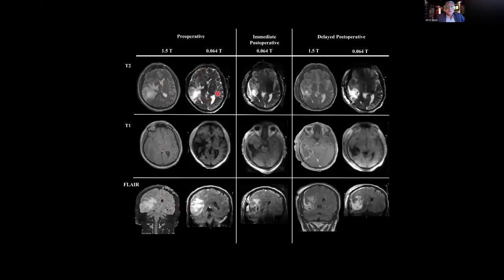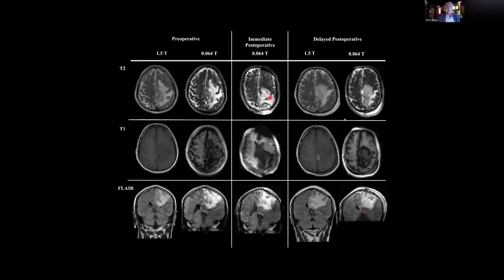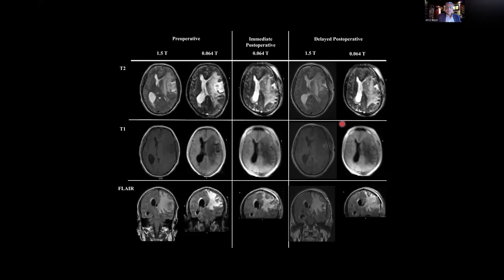If I get this picture, this is more than enough for me to make my plan. It would be good to have a high definition image, but this is more than enough for me to plan somewhere up in the boonies when I come across this patient. And then you can get a delayed post-op MRI, which shows what kind of surgery was done. It does give me a fair, decent idea of how well I did the surgery. And here's another example of that patient that shows this 1.5 Tesla, 0.064 Tesla, and comparison of these in the pre-op and in the post-op stage. And this is the last example I'm showing you. Again, this is a high-grade glioma patient.